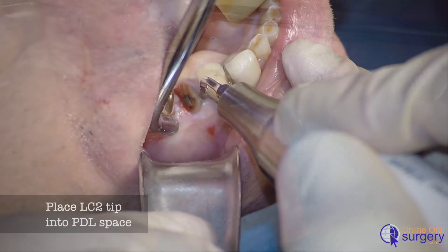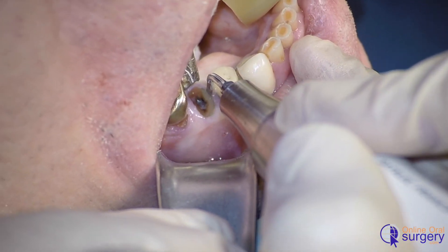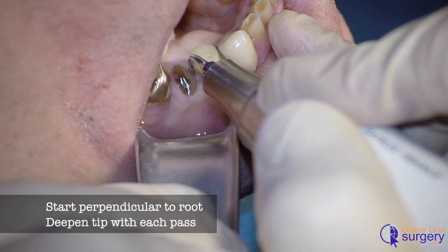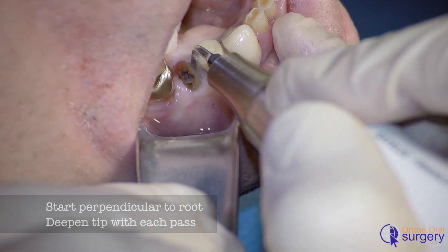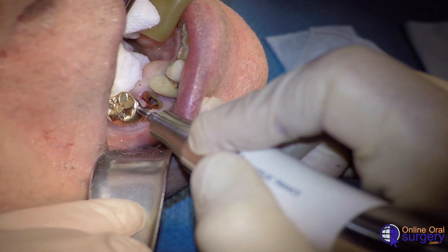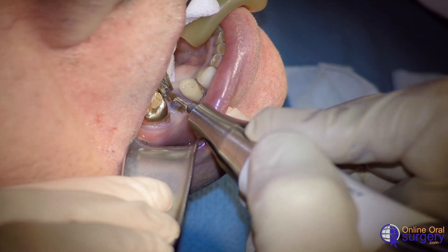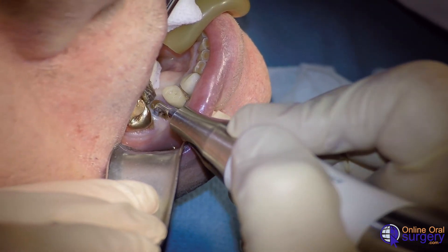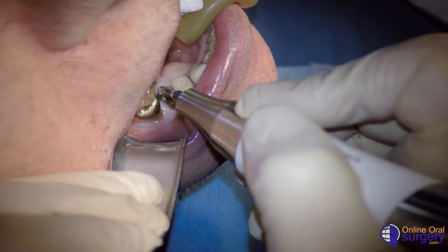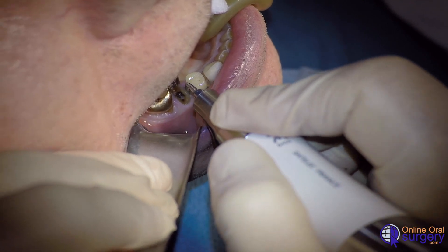Following our incision, we're going to take this periatome tip and enter into the space between the root and the alveolar bone on the mesial aspect, dragging it perpendicular to the root — buccal-lingual or lingual-buccal — on the mesial side of the root, passing a little bit deeper each time. Then I'm going to do the same on the distal aspect of the root, going between the root into the PDL space and going perpendicular to the root in a buccal-lingual direction, each time passing just a little bit deeper to accentuate that space. Once begun, I'm going to go back on the mesial aspect and rather than going buccal-lingual, I'm going to go superficial to deep to deepen the separation of the PDL in a couple different spots.